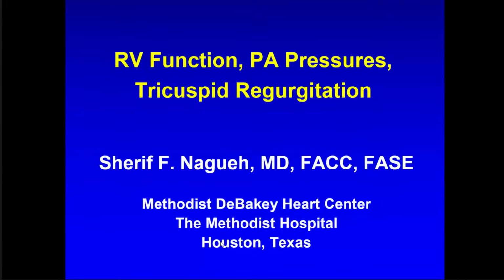Function and pulmonary artery pressures, and tricuspid valve regurgitation using echocardiographic assessment tools.